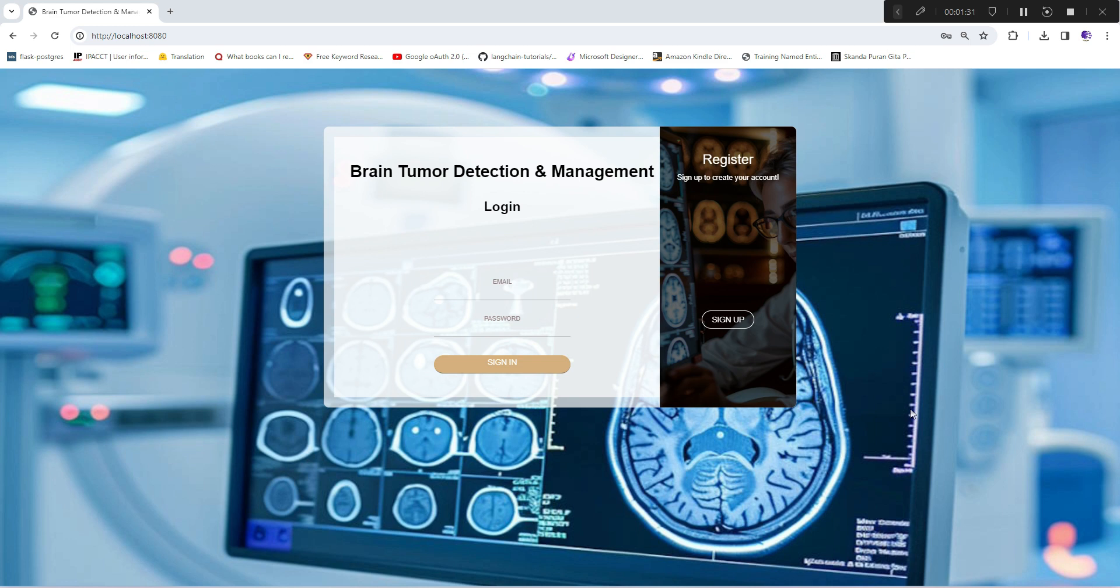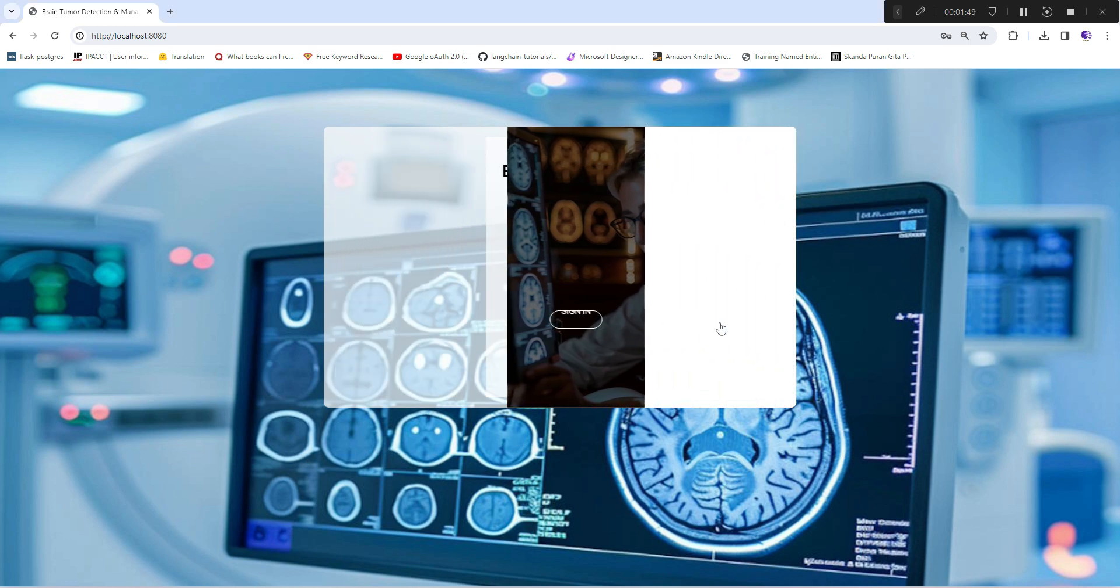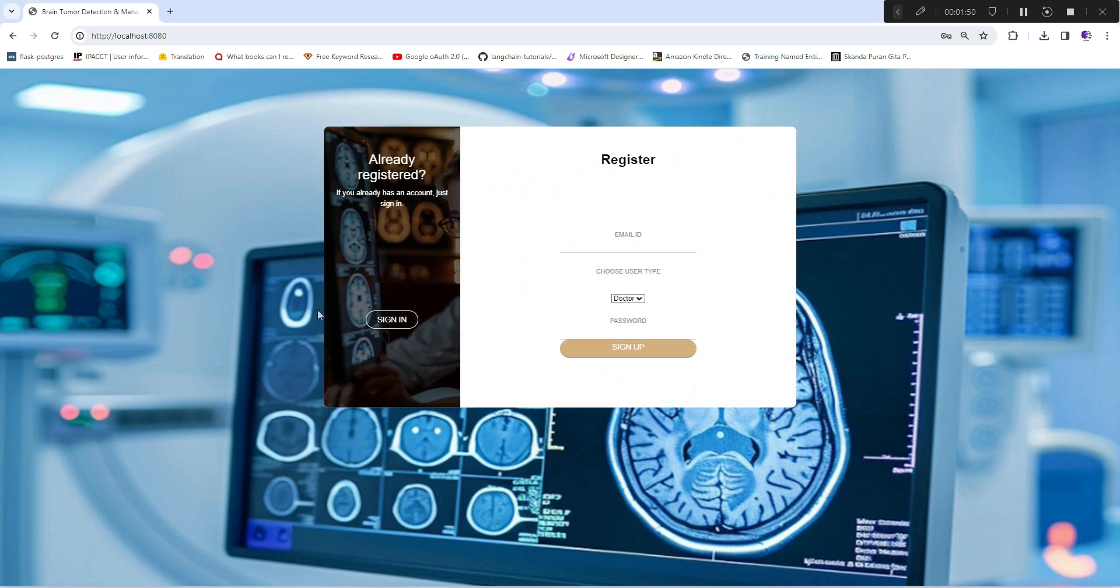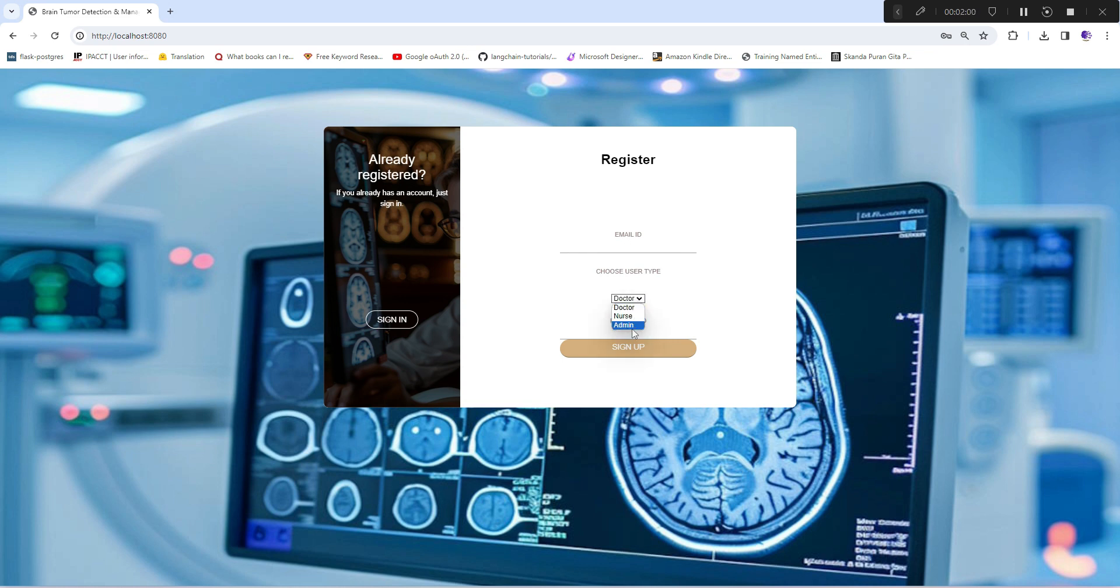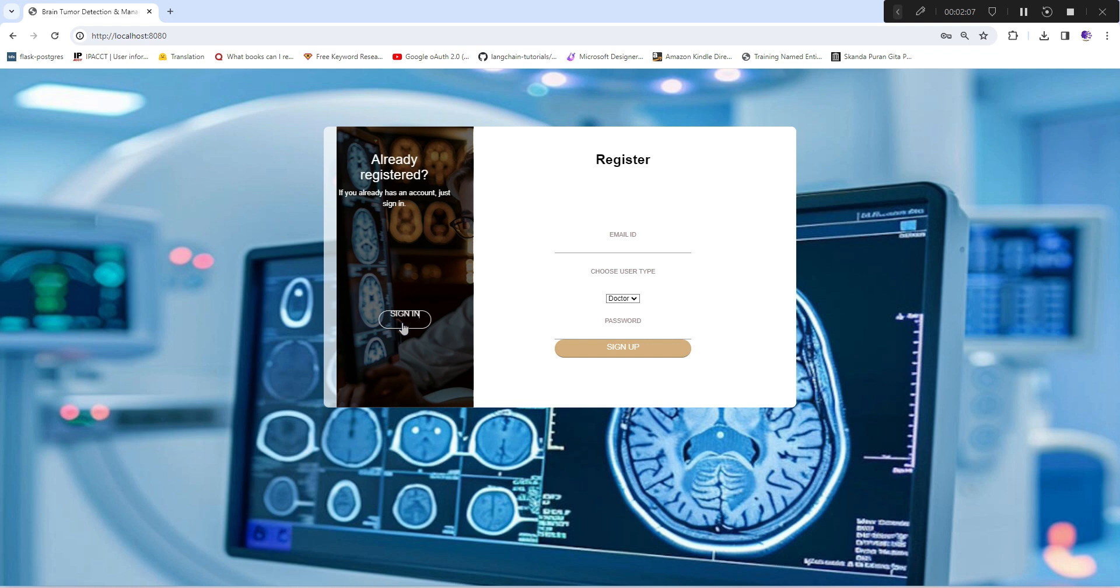I'll quickly show you this application by starting with the nurse role. The signup section is the same as I've shown you in the skin cancer detection system, where users enter email ID and choose from three options: doctor, nurse, or admin, and register with a password.